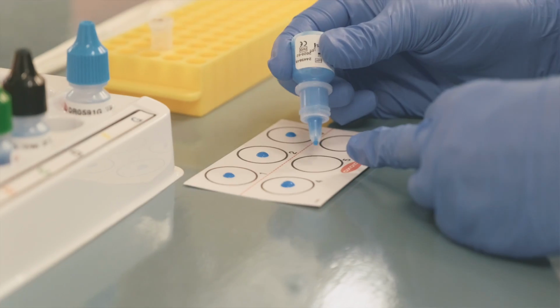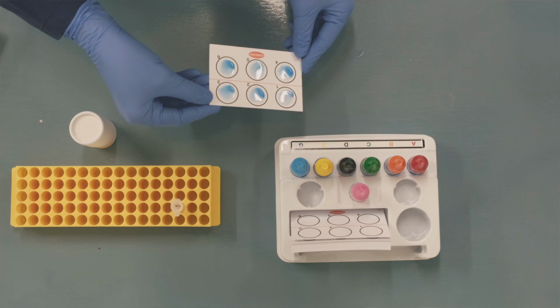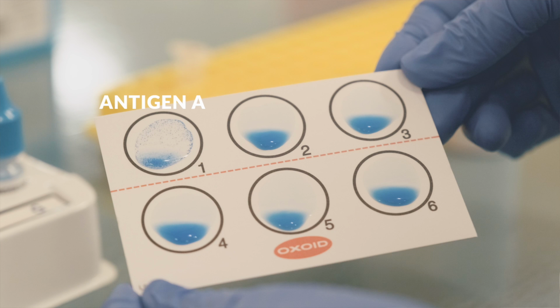We can also use a commercial immunological testing kit to differentiate Streptococci by their Lancefield Antigen. Each reagent contains an antibody targeting different surface antigens unique to each type of strep, and we are looking for positive reactions in the form of agglutination. The strep should only react with one of these reagents, and in this case, our sample reacts with group A antigen, confirmation that it is Strep pyogenes, also known as group A strep.